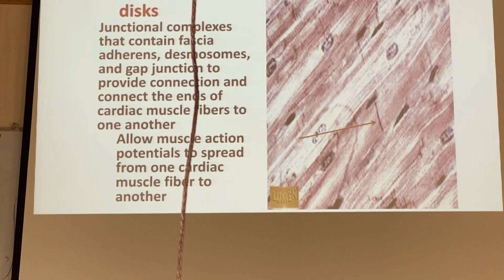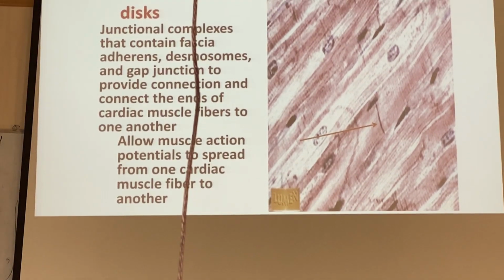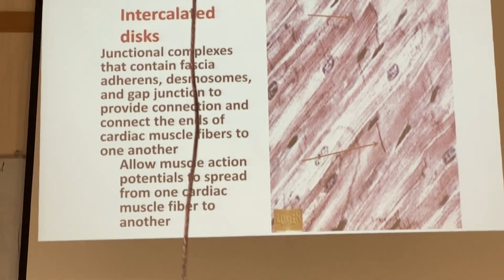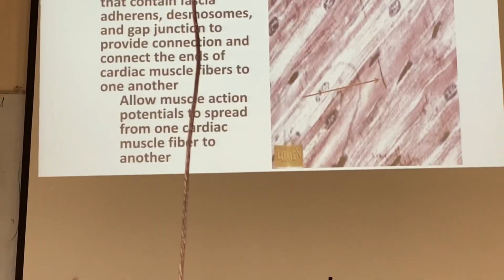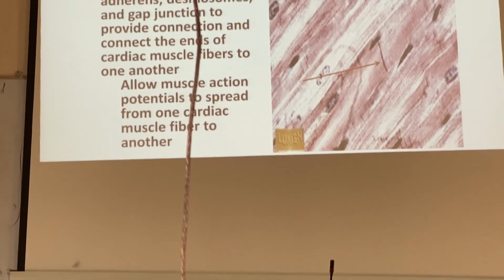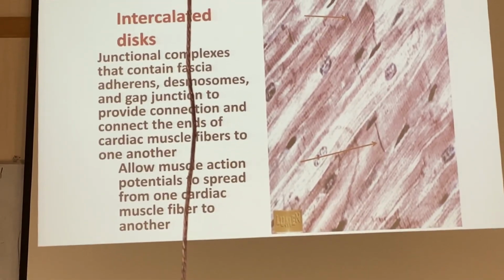Now, read the characteristic features. Junctional complex that contains adherens, desmosome, gap junction. An intercalated disc.